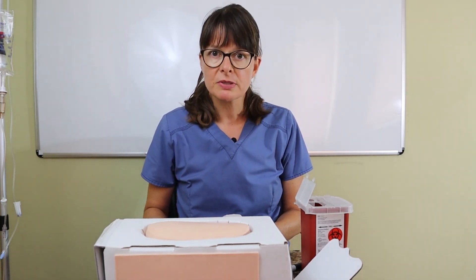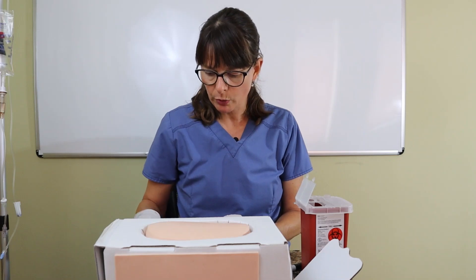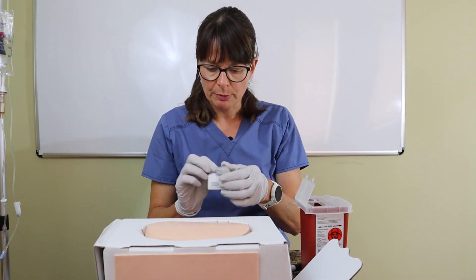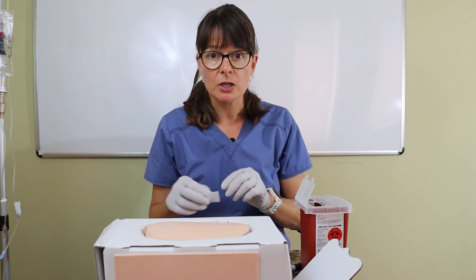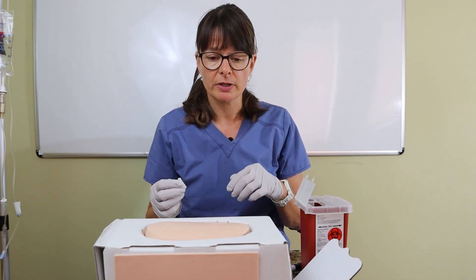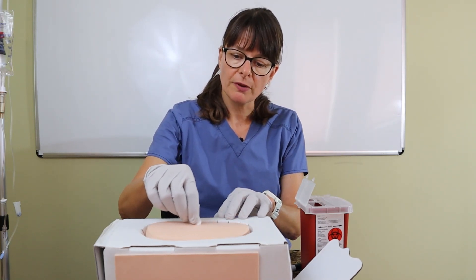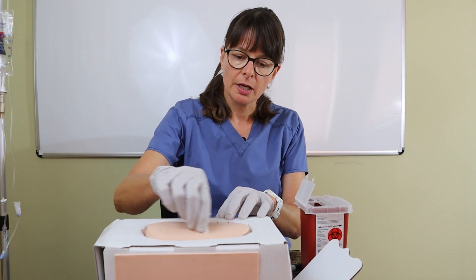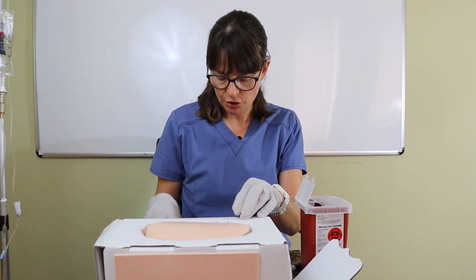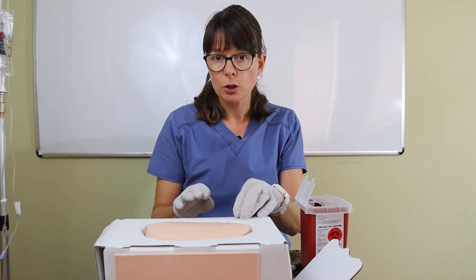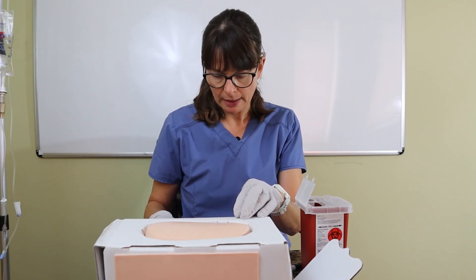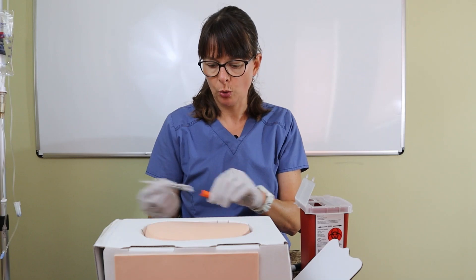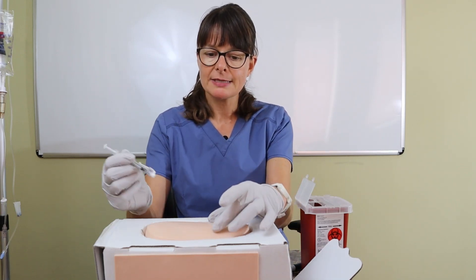I have prepared an insulin syringe with 10 units and I'm going to give this subcutaneous injection at 45 degrees. As always, we want to prepare our patient after we've verified all the patient rights of medication administration. I want to clean the site from the very center in a circular motion outward, which will help carry any contaminants from the skin away from the injection site. Make sure you let that air dry — don't blow on it, because then germs from your mouth might reach the site.